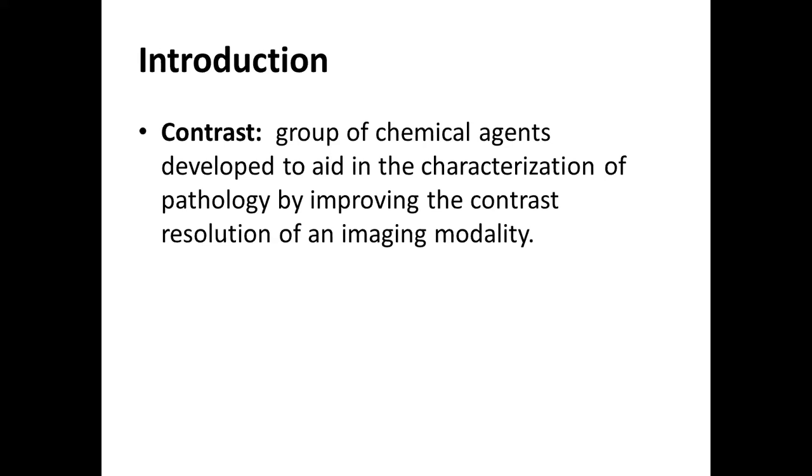So for us to study this tract, we are supposed to put in contrast agents, which is in form of a dye, which is taken orally. It fills the lumen. Then the density of this tract becomes more than the density of the bones, hence evaluating the pathological processes that are going on in this hollowed organ.